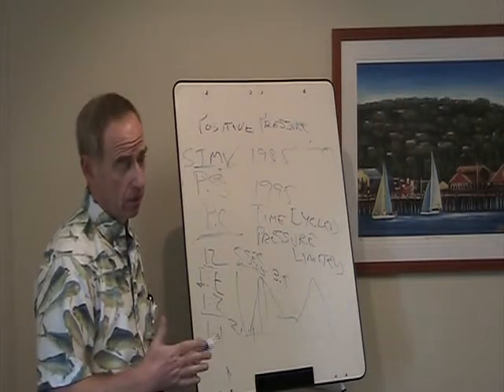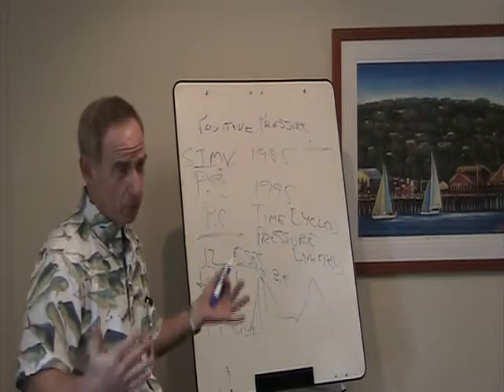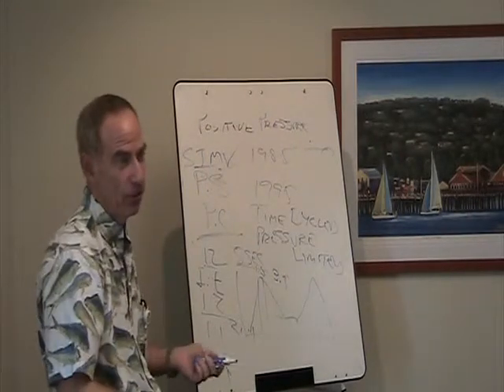So one benefit is that you get this air trapping auto peep or intrinsic peep effect, but there's really not a big advantage of that kind of peep from just applying peep with the ventilator.